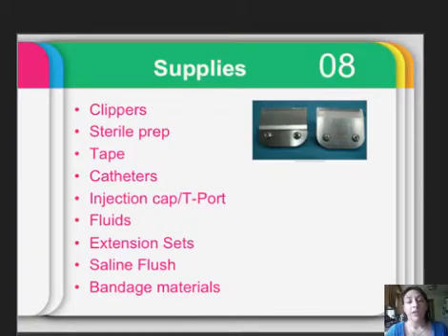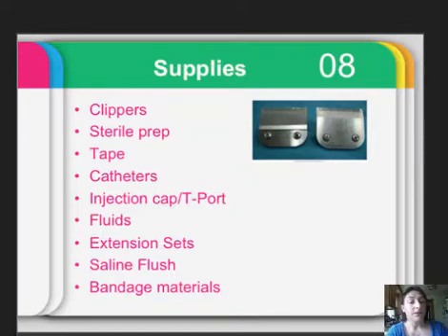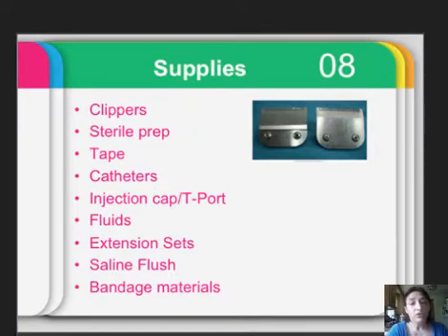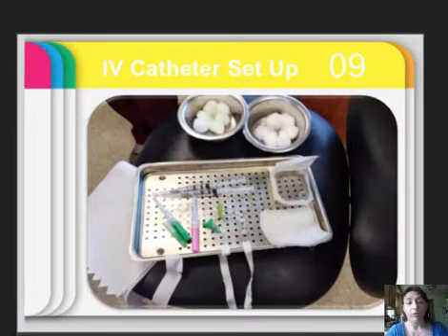In order to place a catheter, you'll need clippers with a 40 or 50 blade, sterile prep with chlorhexidine and alcohol, and tape. Check the catheter to make sure there are no burrs and that it moves freely. You need about two pieces of one-inch tape that will encircle the length of the limb — one split in half — plus vet wrap, an injection cap or T-port (flushed properly with the clasp closed), two syringes of heparinized saline (normally 3 cc), gauze squares, and a piece of paper towel to keep things clean.